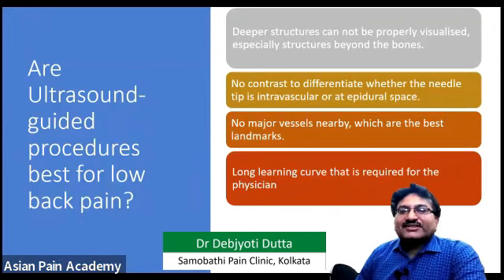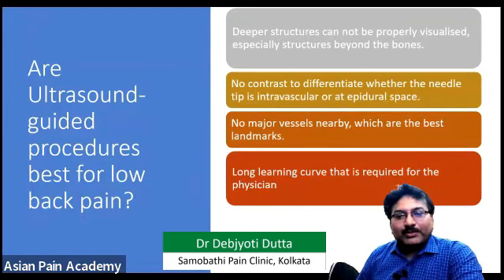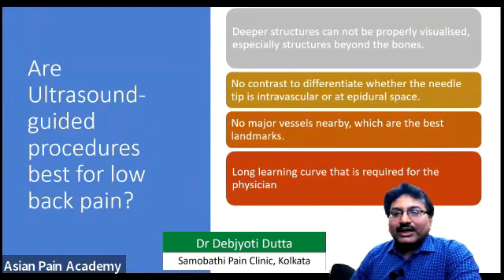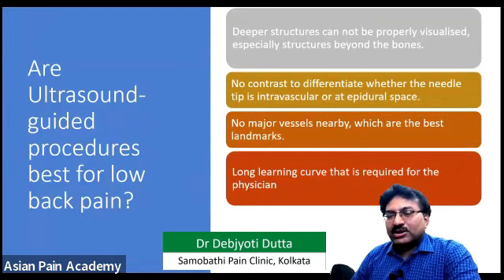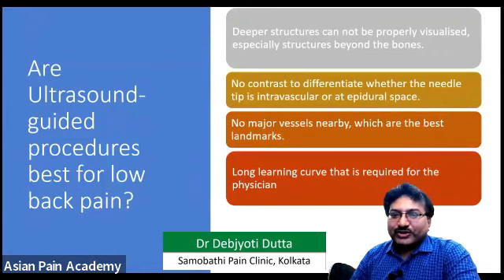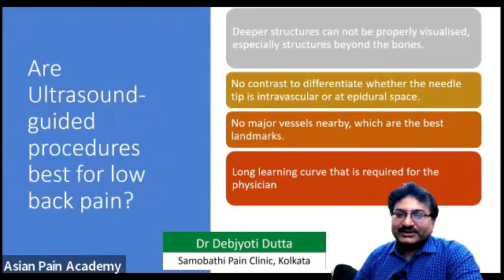Now, are ultrasound-guided procedures best for low back pain, instead of fluoroscopy? No, it is a mix, because ultrasound structures cannot be properly visible. Deep structures, especially, cannot be properly visualized with ultrasound. Especially if any structure is beyond the bone, it cannot be visualized.